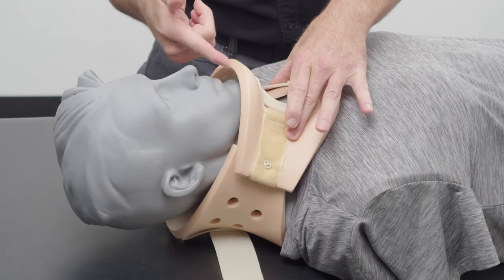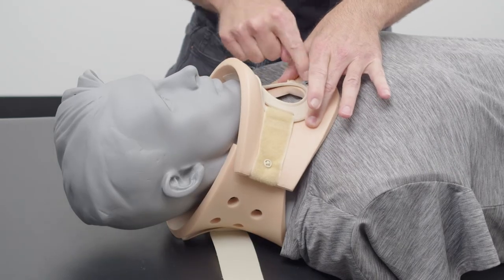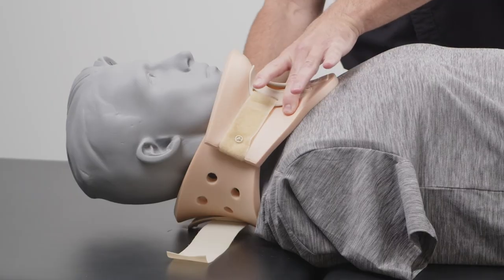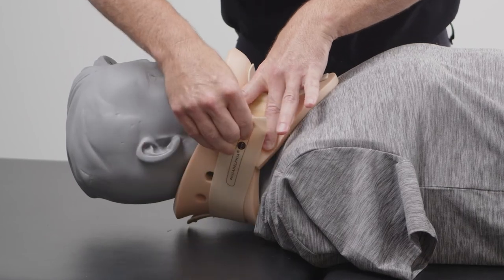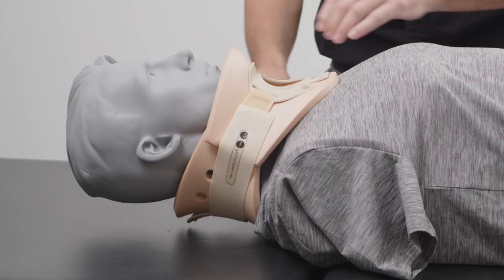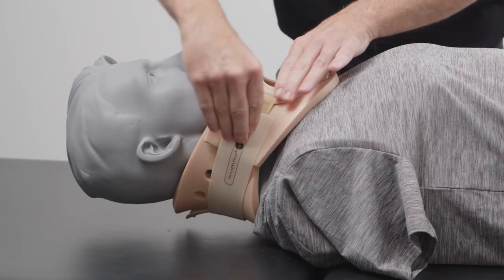Please note that the chin is in the recess and the tracheal opening is in midline. Next, we will begin by securing the hook and loop back and forth until we get neutral alignment of the straps.